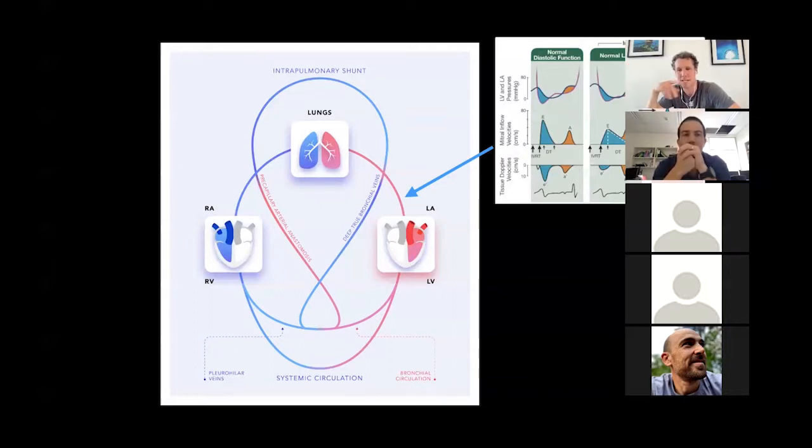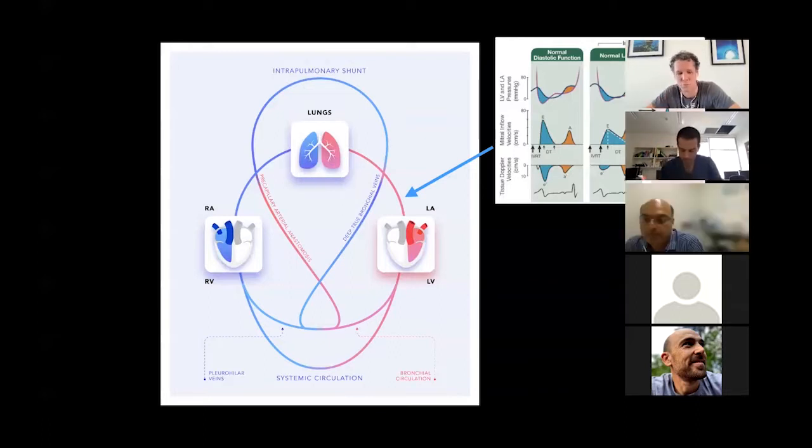So Sid, let's talk about what are the problems with all of these, particularly in the critically ill, right? Because both Vishal and Lewis here have quoted the ASE guidelines for the thing that we looked through. And very clearly in the first sentence, I think they talk about it not being very good in the perioperative setting or the pediatric setting. I think they also probably mean in there the critically ill setting.